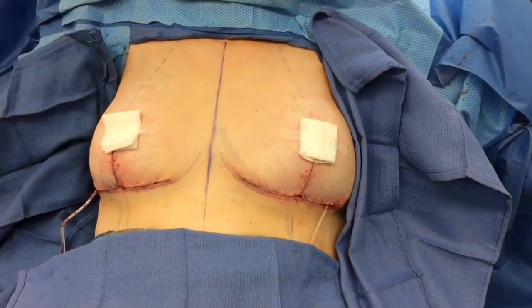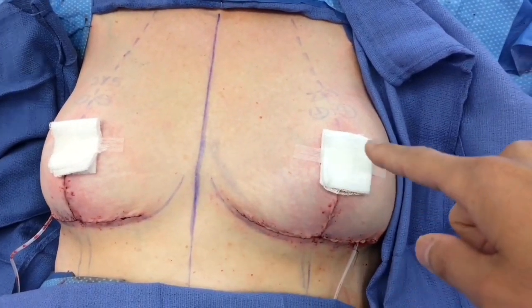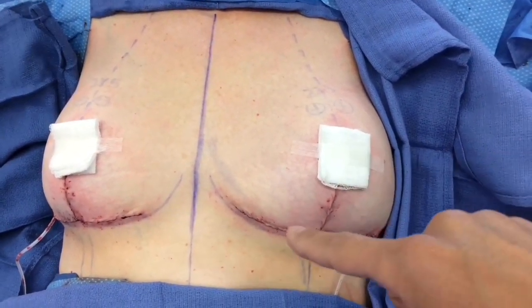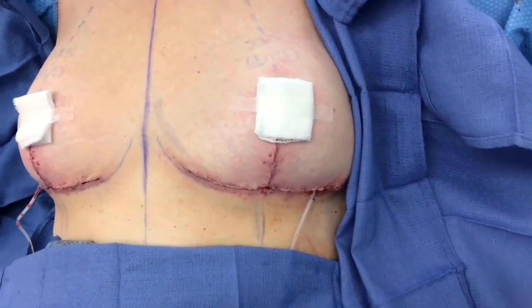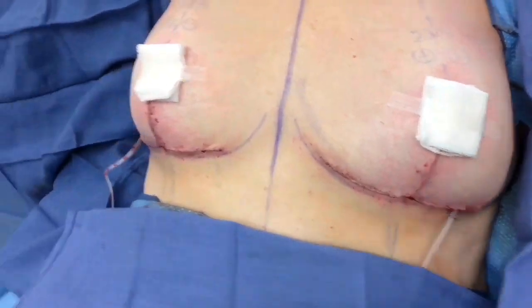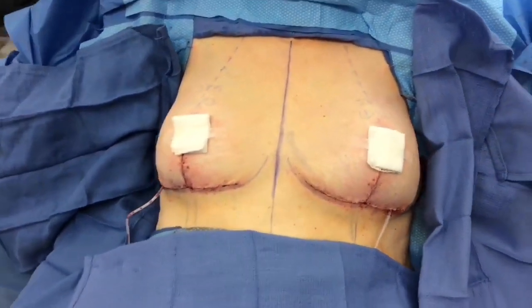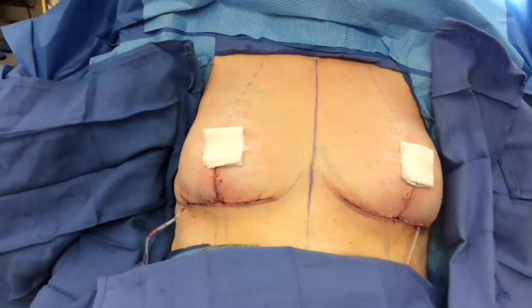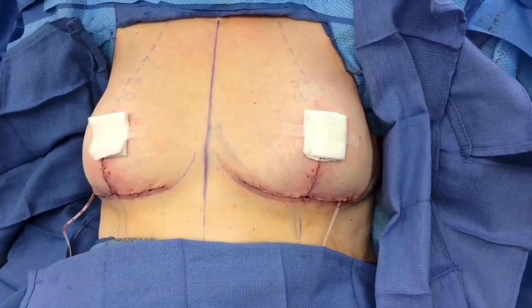Okay, we are all done with the lift. Everything went really, really well. I covered up the nipples here, but she does have a little scar around her areolas. Coming down, you can see underneath. The little drain we're going to keep in just for 2 days. Did some liposuction of her sides as well, so that's going to contour really nicely there, as well as on that side. So I'll hopefully be able to show you her results when we're all done. Already getting a little swollen on the operating table. It's just going to get better and better.